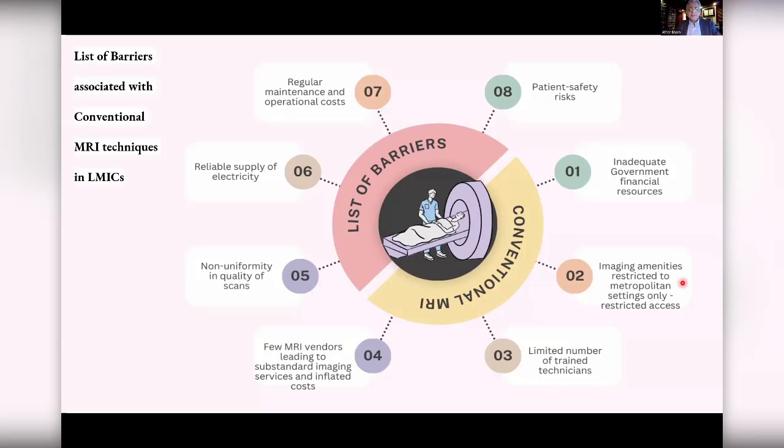So coming to the summary of the ultra low field MRI and the regular MRI, how does it really fit in with the LMIC, with the resource limited setting? There is an issue of inadequate government financial resources, and that's pretty wide across all LMICs. The imaging amenities are restricted to metropolitan settings only, so we don't see this in small towns and other areas, and that's why patients have to travel 50 plus kilometers and maybe up to 500 kilometers. There's a limited number of trained technicians. There's always a shortage, because those who get trained are just sucked out into some Middle East or other country because they get better pay over there. So we always have a shortage of trained technicians.